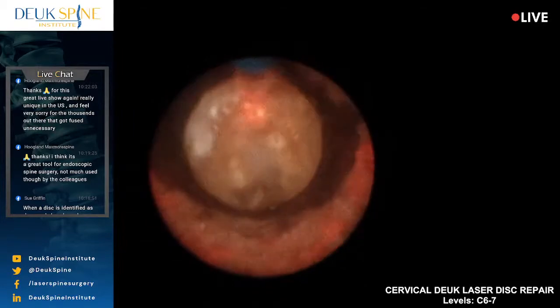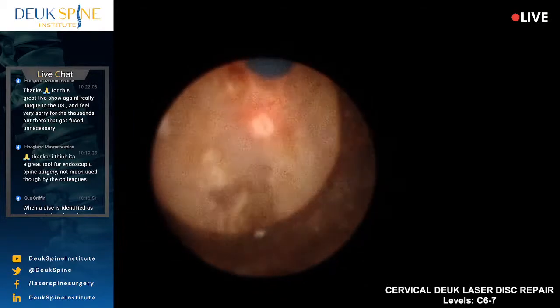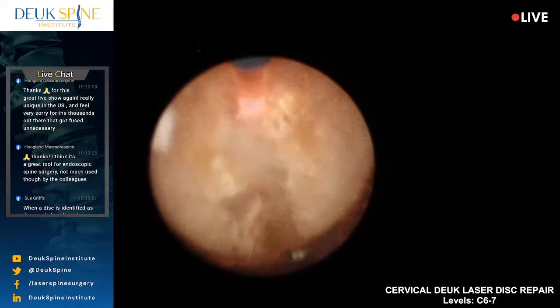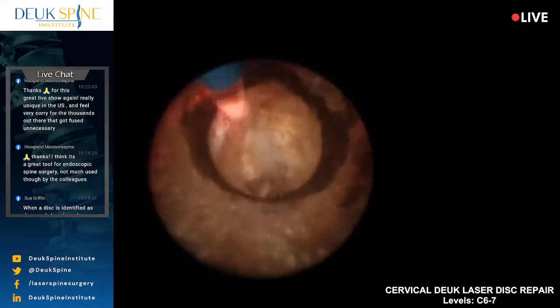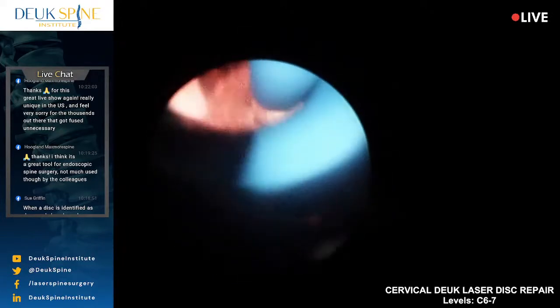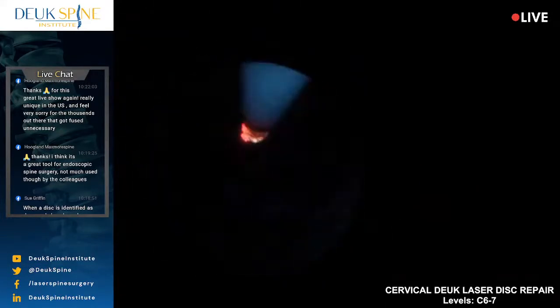Come down and look. This is all arthritis. Really severe arthritis. All right, well, I feel we've done everything we can. We're done. Lights on, please. Scope off, please. Thank you.